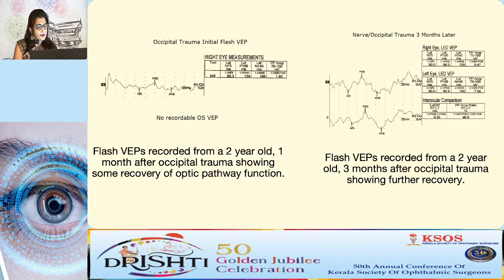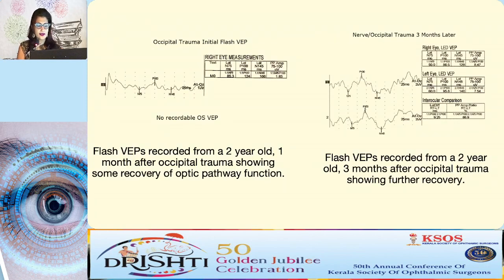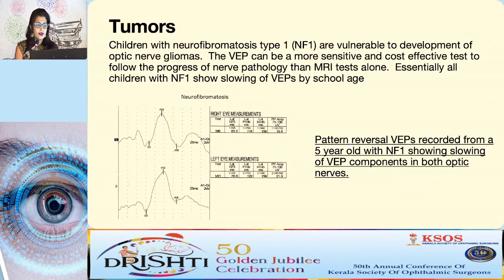Flash VEPs 1 month after occipital trauma show some recovery. The earlier one had no waves at all, and now you can see that there is some amount of waves coming, and then 3 months after there is further recovery.